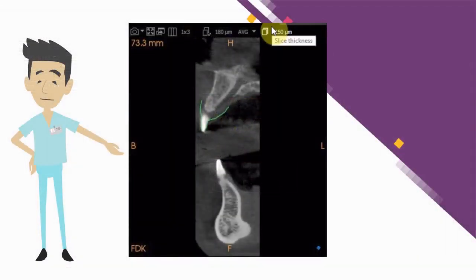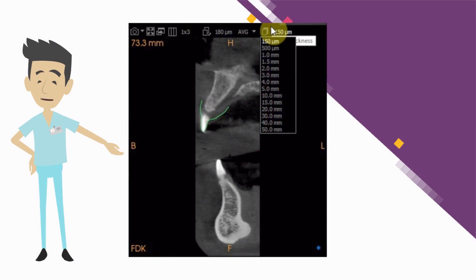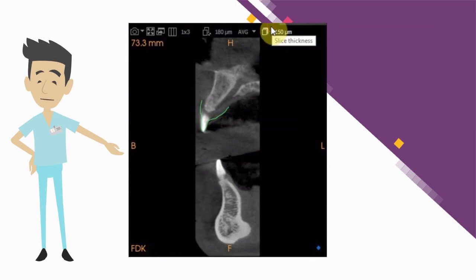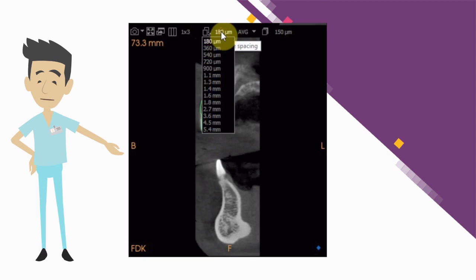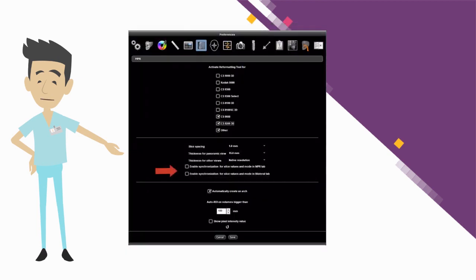Slice thickness and slice spacing are now rounded to more understandable values for the practitioner. Also, modification of slice thickness in one view, for instance axial, can now be synced with the coronal and sagittal views when selected in preferences.